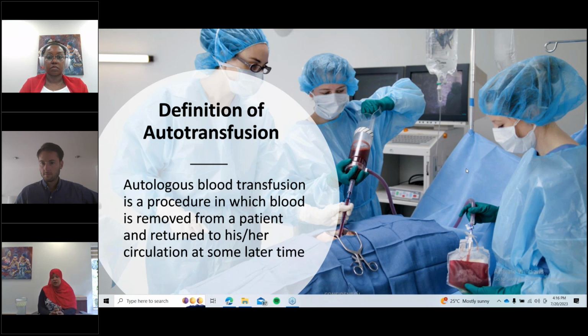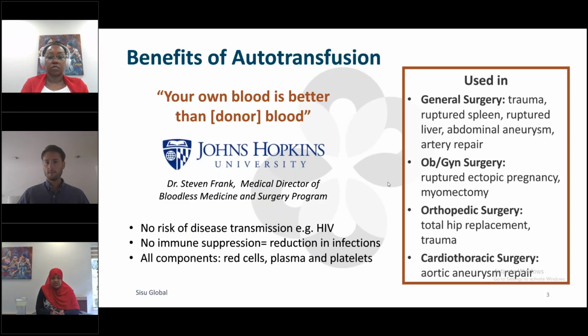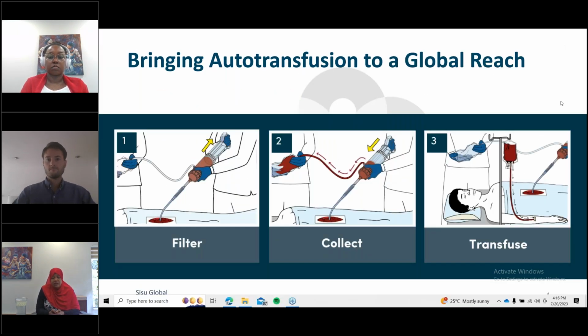Now, I want us to see the device itself, and I will jump into the demonstration of the device. So the Hemafuse device comes in 3 parts. It comes with a pump, which comes non-sterile and needs to be sterilized, and it can be used up to 25 times. The second is the filter, and then we have the accessory kit. The filter and the accessory kit come already sterile, and they are single-use devices. All these come pre-packed in a sterile pack.